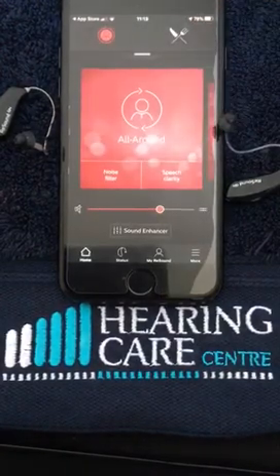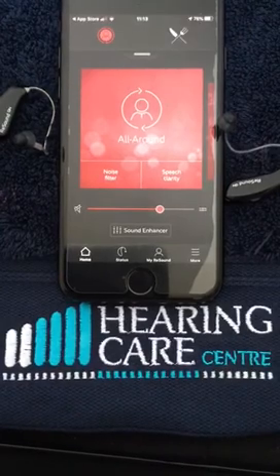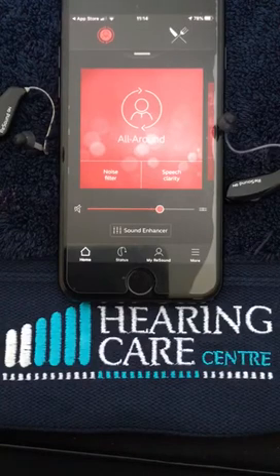And we go back to our everyday app screen. This will connect every time you switch the hearing aids on, so you don't have to pair it every time. I hope you found this useful. Thank you.